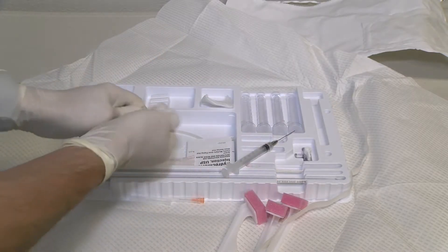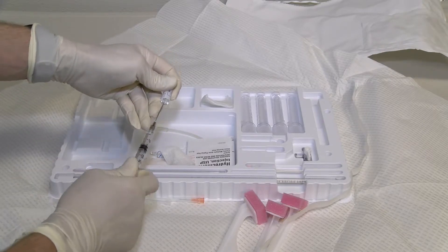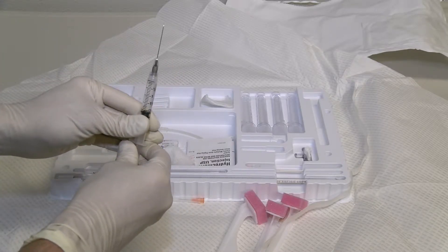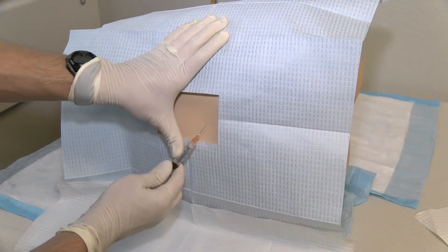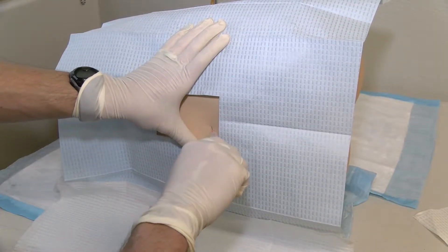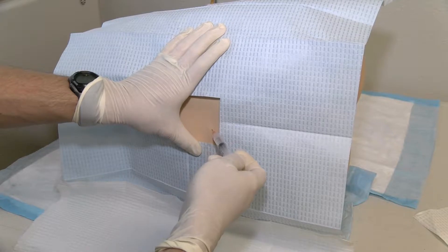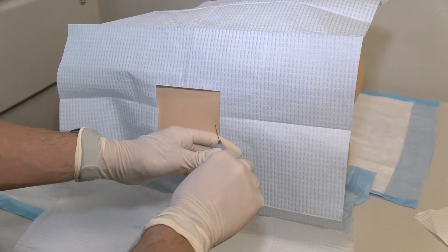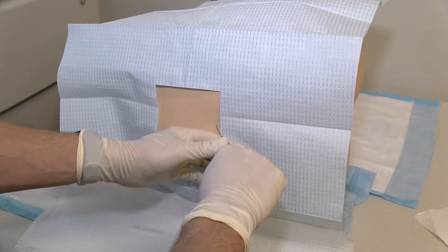Draw up 1% lidocaine and inject a small wheal at the planned insertion site using the small needle included in the kit, between the spinous processes as palpated. Be sure to talk with and describe the steps to the patient as you perform them, as the patient is often awake but unable to see what is happening. Once a wheal has been injected, a longer needle may be used along the planned trajectory of the spinal needle to anesthetize the track. This will also give an indication of bony obstructions and can help confirm direction for final needle placement.